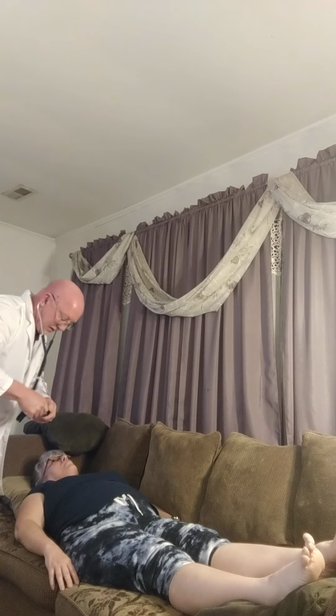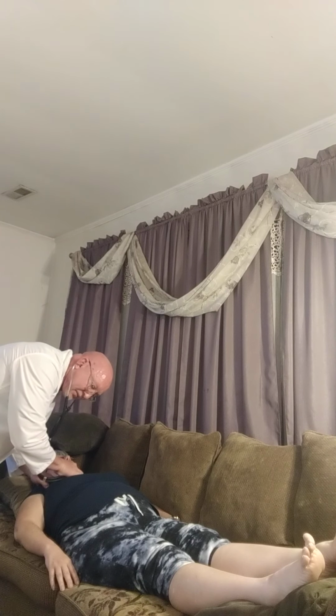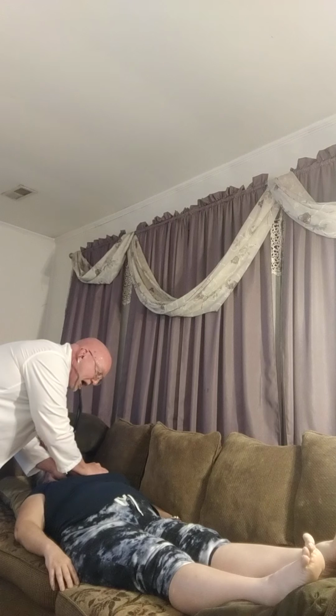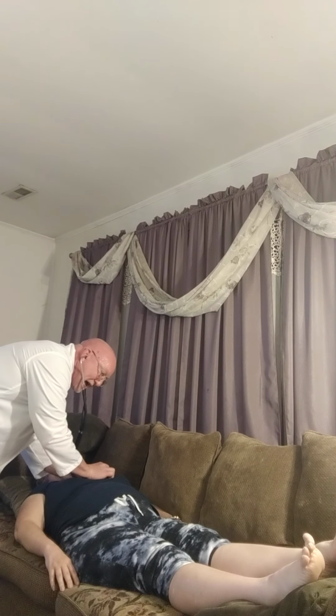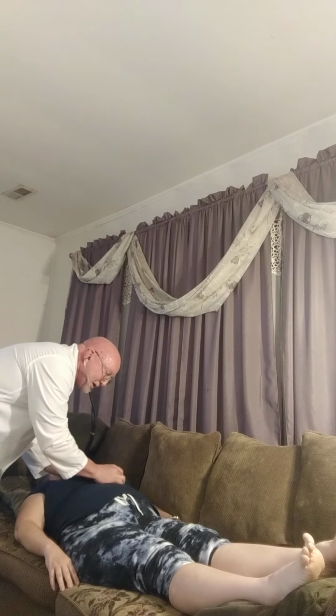Apex. Flip it around. Do the same thing with the bell. Follow them right down. Erb's, tricuspid, 5 is bicuspid.